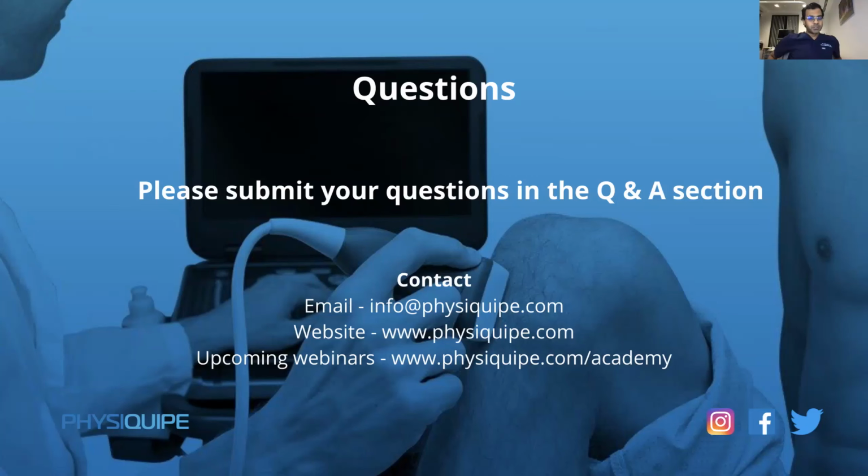I'll be honest, I don't have much experience with dynamic MRI imaging if it's a case of positioning patients into different areas. Of course, we know that a conventional MRI scanner is a static imaging test where patients are often not load bearing and they're lying down most of the time.